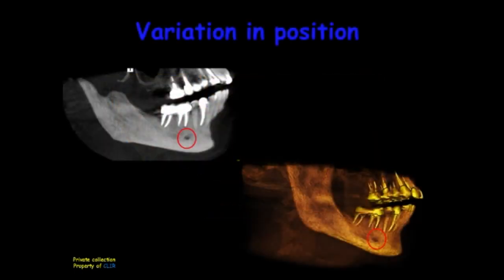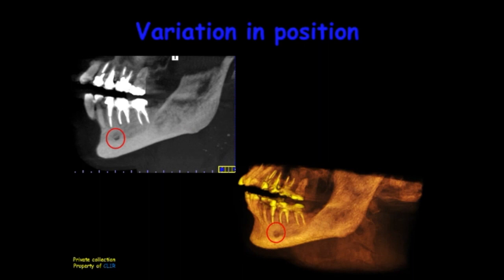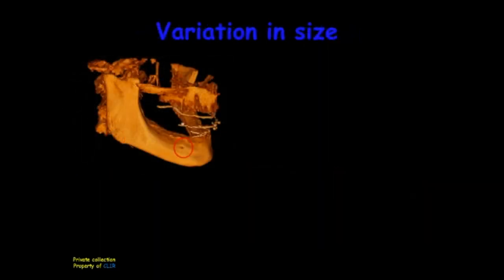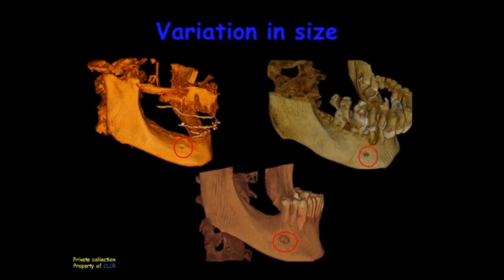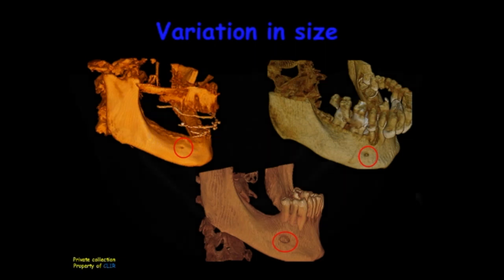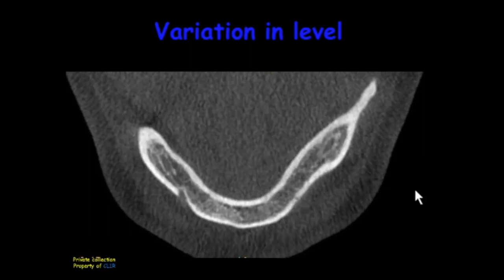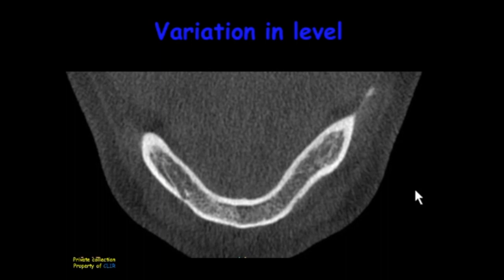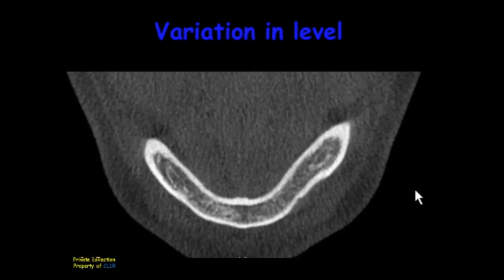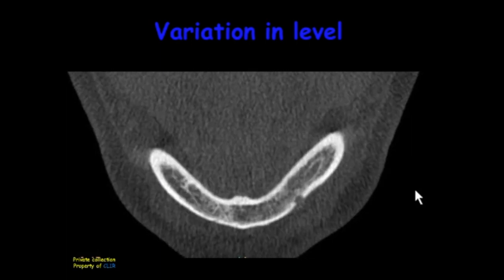Sometimes we can have a variation in the positioning of the mental foramen, like in this case, where you can see that the position is between the second premolar and the first molar, on the right and on the left side. We can also have different sizes, going from a small opening to a larger one. We can also have a variation in the level of the mental foramen on the right side and on the left side, as you can see on these axial cuts — the two foramina are not on the same level.